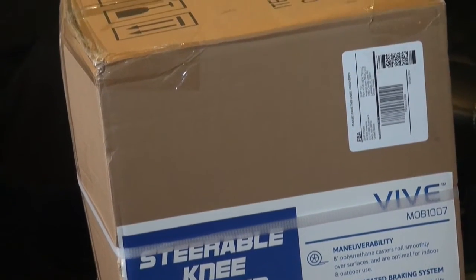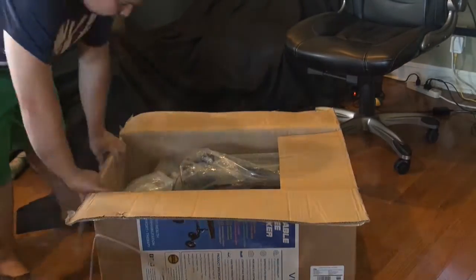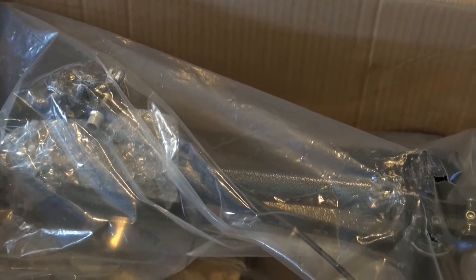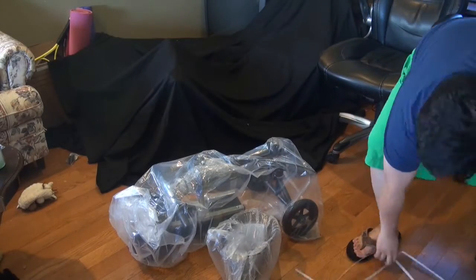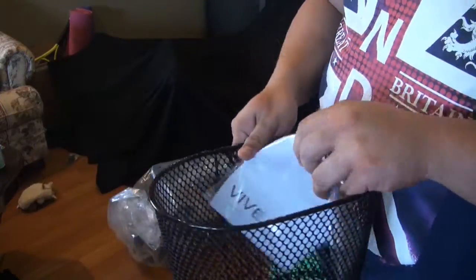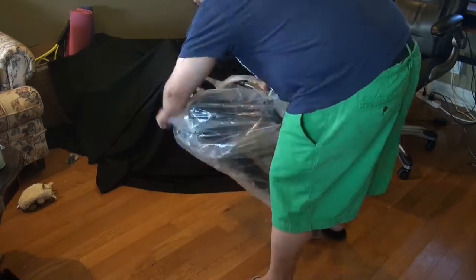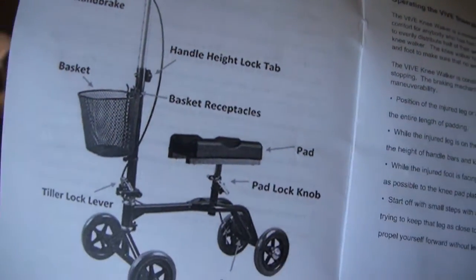We're going to open it up. When you open the box, this is how it looks like. First we have the basket, then we have the other parts, and the manual here. This is the manual which shows the parts of the scooter.